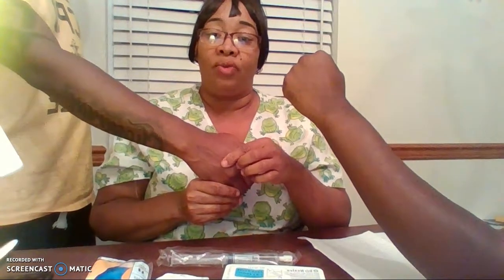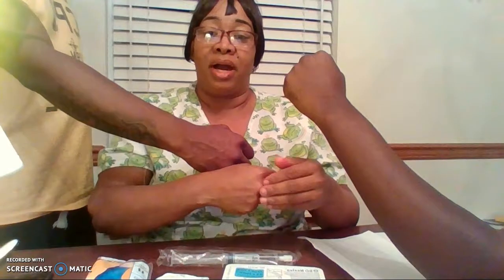As you can see on this gentleman's hand, he has a couple of veins that are easy to identify because he is more muscular and healthier, probably very hydrated as well. So even though the veins look good in theory, they are very mobile, and so you will need to hold them in a manner in which to secure them and start a line on him. And then, as you can see on my hand, mine are not as pronounced as these, so once you apply the tourniquet and start to pump them up, they may pump up and look like this. These are very spongy, and you can find where they connect.